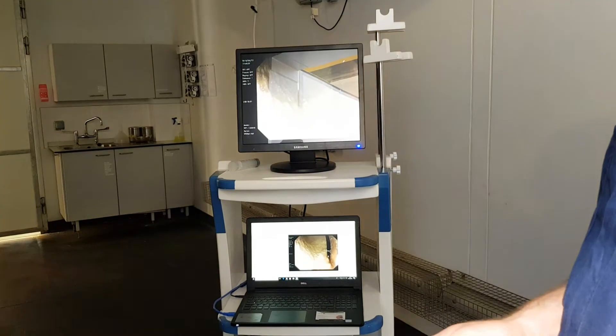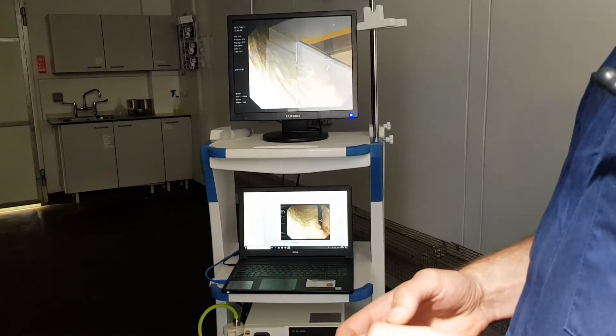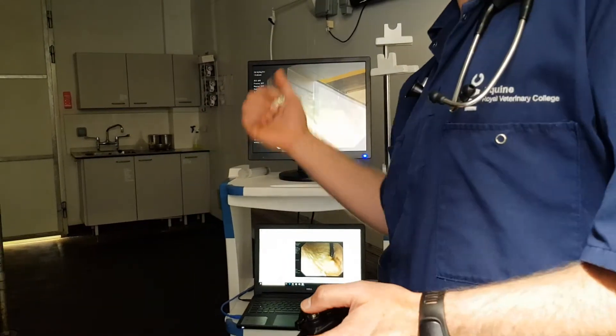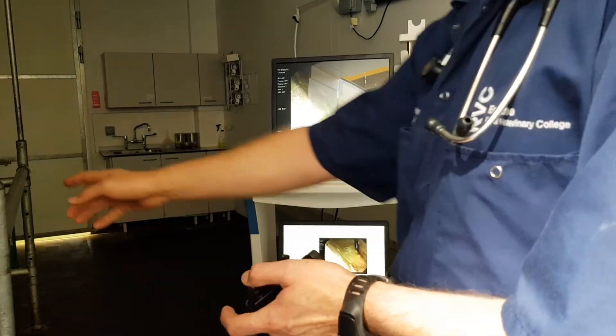Hi, come through. Could we toggle the hemoglobin? I'll tell you what, why don't we just do a basic exam first, then we can play around with some of the images. So, we're in the stomach now. Do you want to just take a penny up a little bit?